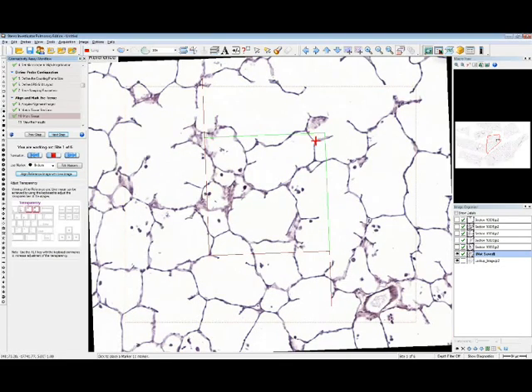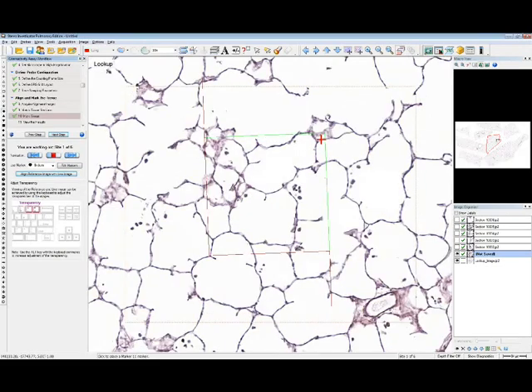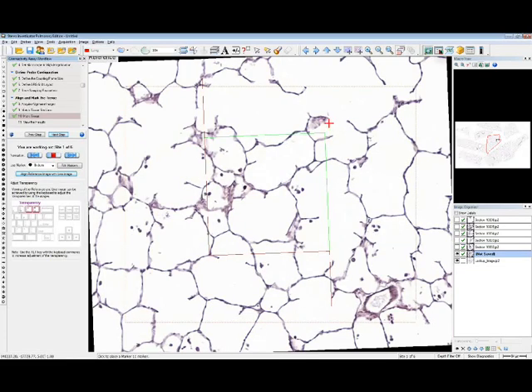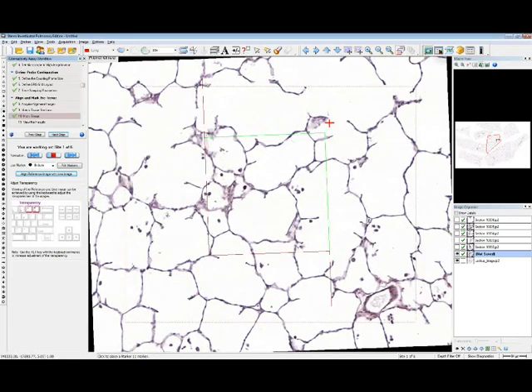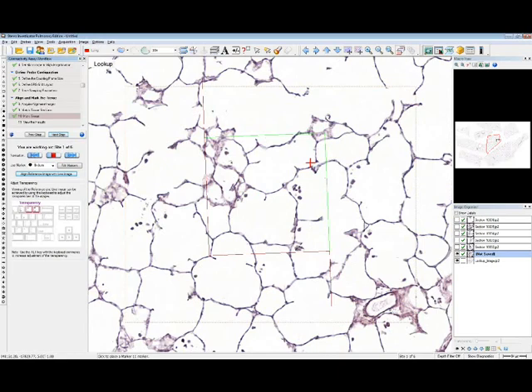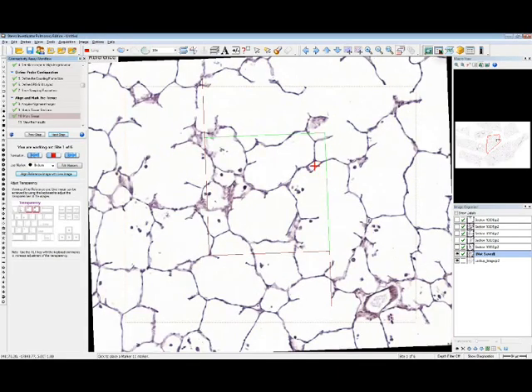And for instance, you can see over here on the right-hand side at the very top of the counting frame, we're looking at lookup, and then we're looking at reference. Over here, you can see that outside of the dissector, we do have a bridge connecting. That is, however, happening outside of my dissector, so I will not count it because it needs to be inside of my dissector. But let's see over here.